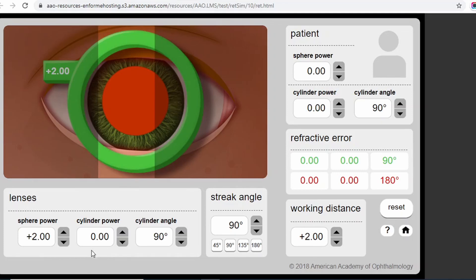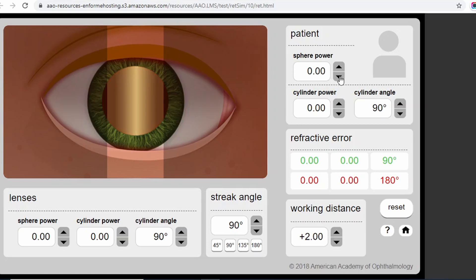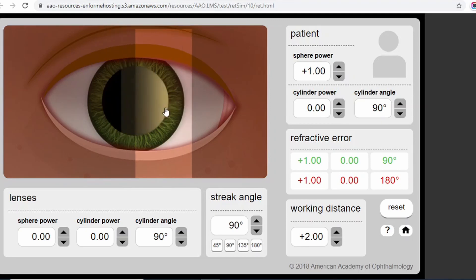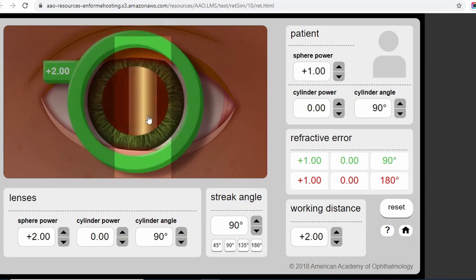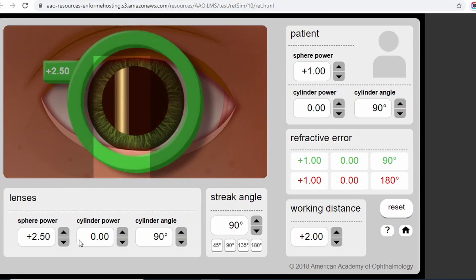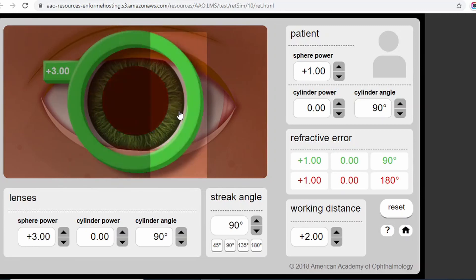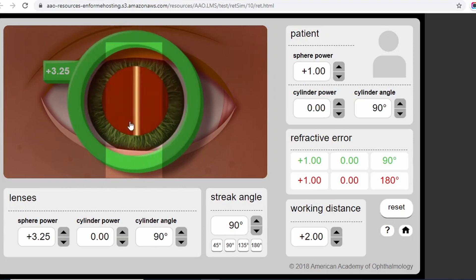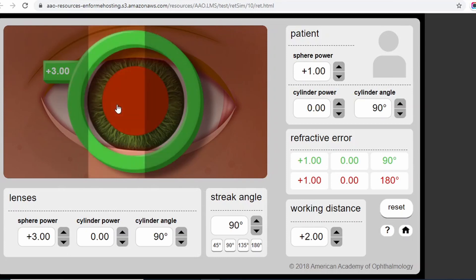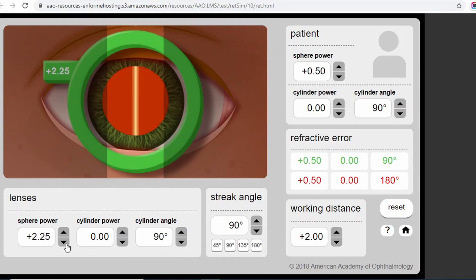This is your neutralization point. The final result will be plus 2 in your trial frame, and your working distance is plus 2 — we deduct it — so the patient's actual power is zero. Now suppose the patient has plus 1 power. I will reset it, fix my working distance at 2, and with plus 1 you will see with movement. Let's increase to 2 — again with movement — increase more — again with movement — neutral. Always go one step ahead from neutral to confirm it; if you see against movement, that confirms your neutral point.